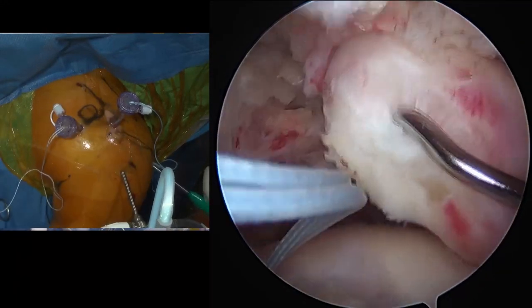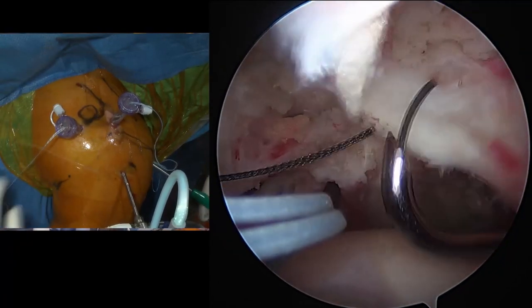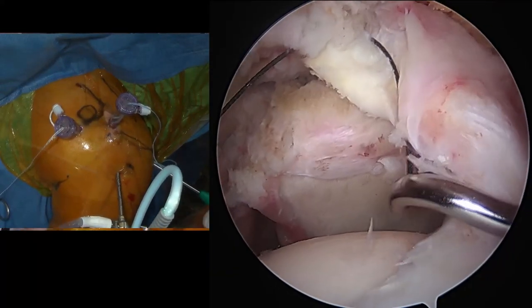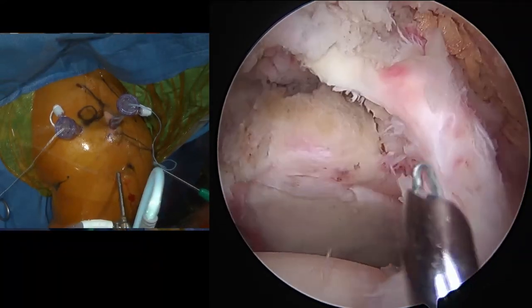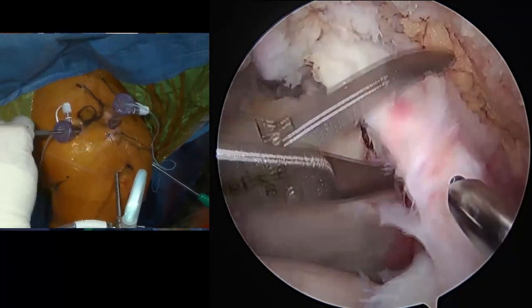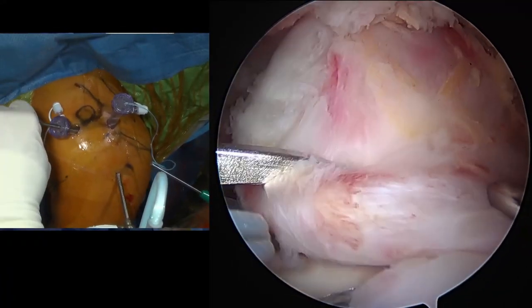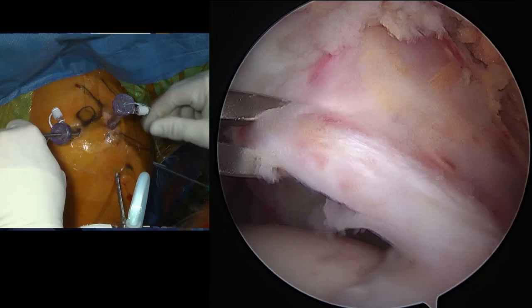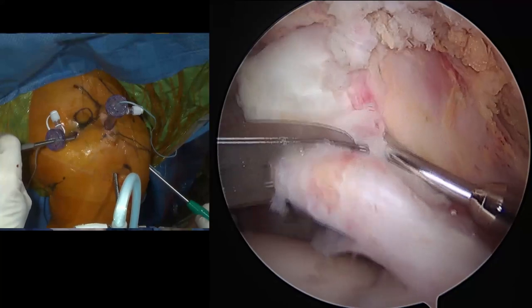Yeah, hang on a second. I thought I had a better bite. Let's start over. Take that out. Take the wire loop out. It looks like it creeped over while we were getting that set up. Okay, so hold the scope again, please. Kingfisher. That wasn't really good tissue that we had there at the end, which I don't want to have to deal with. So that's a muscle tendon junction. There's only so much we can do. That may just be what we have. That's going to give me a little bit better.